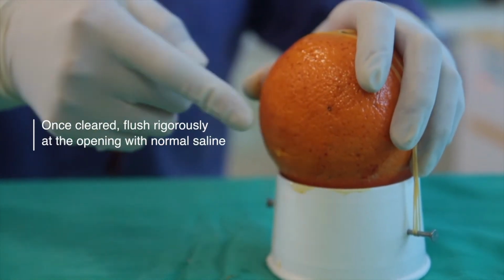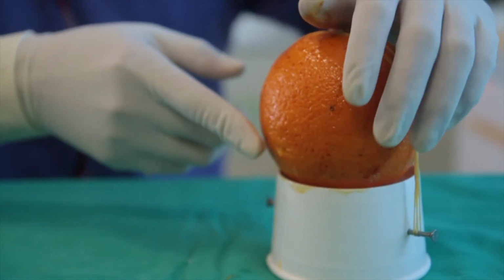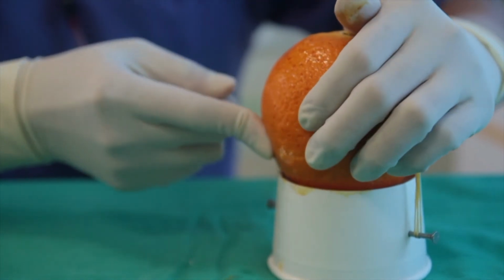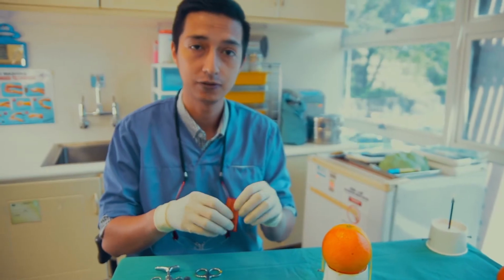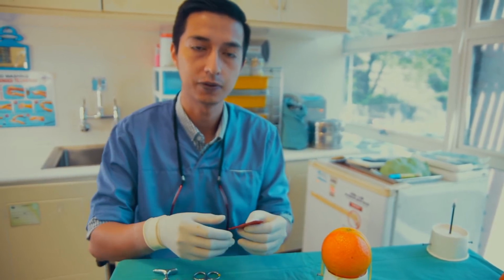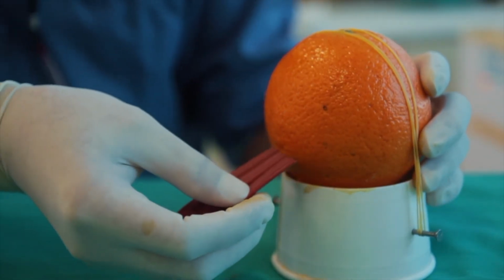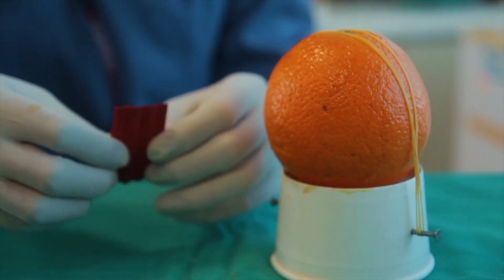When everything is clear, do a rigorous flushing using normal saline from the opening of the incision. The next step will be the placement of rubber drain through the opening of the incision to allow the leftovers of the pus to come out from the side. Make sure we have the correct size of the drain. This is a little too big, so we have to cut it.